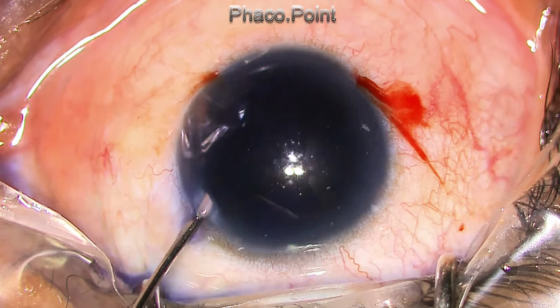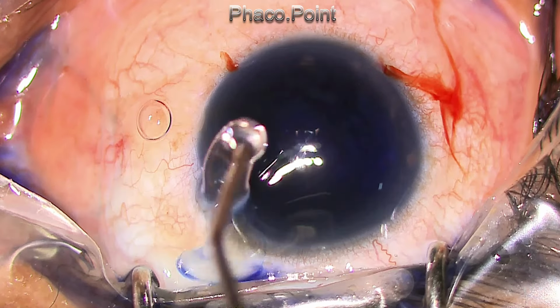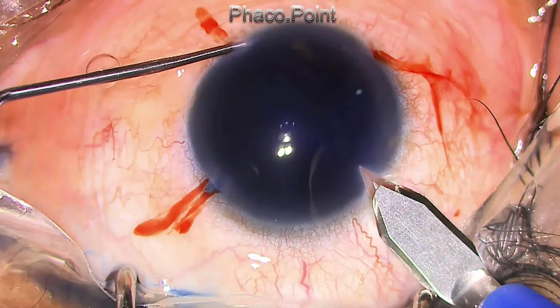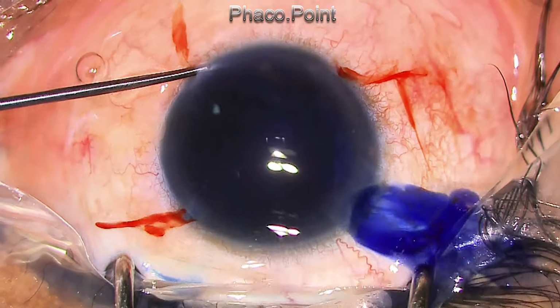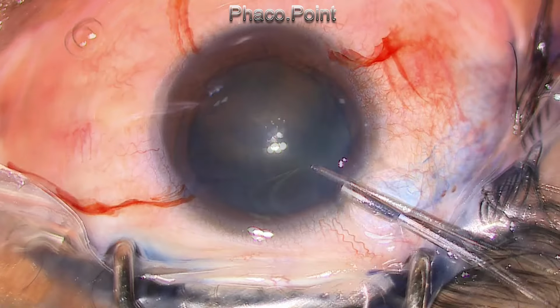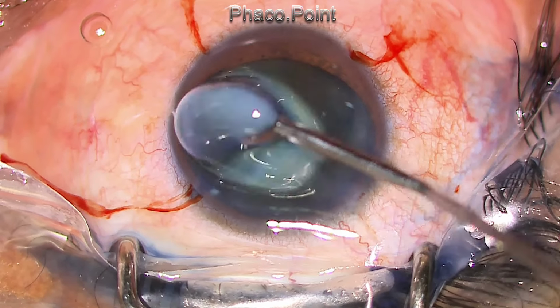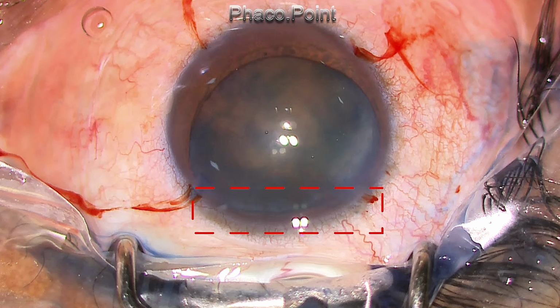I stained the anterior capsule because there wasn't a sufficiently good red glow. And then I went ahead and constructed the clear corneal incision. I anticipated a problem while performing the capsular rhexis because I could see that the superior portion of the lens was quite visible when the patient was fully dilated. This was the portion of zonular dialysis or weakness that I could see.